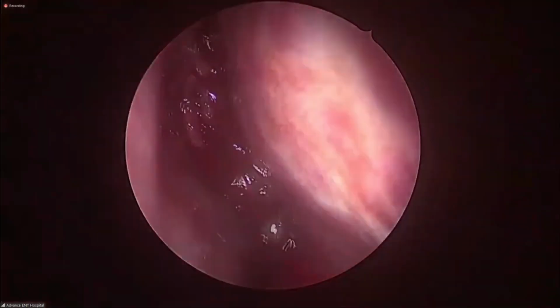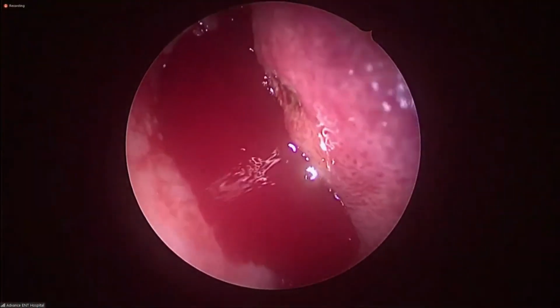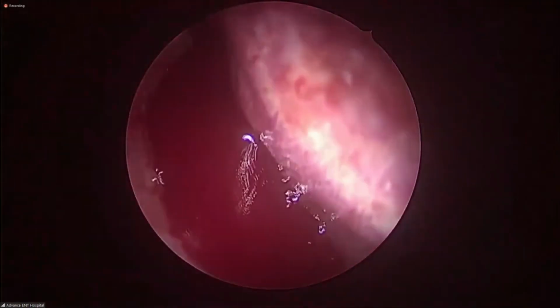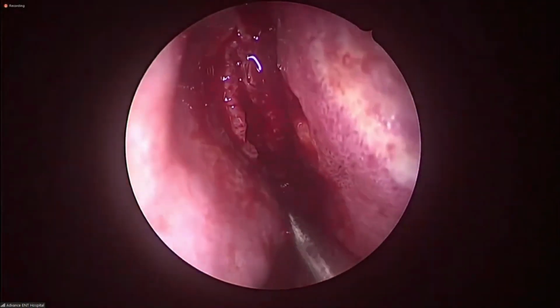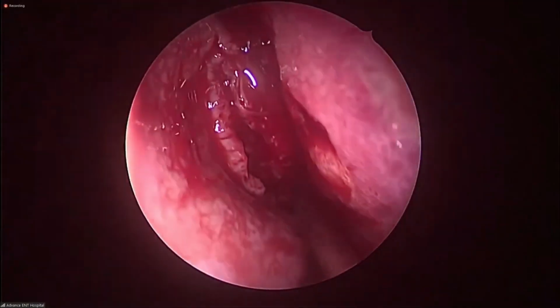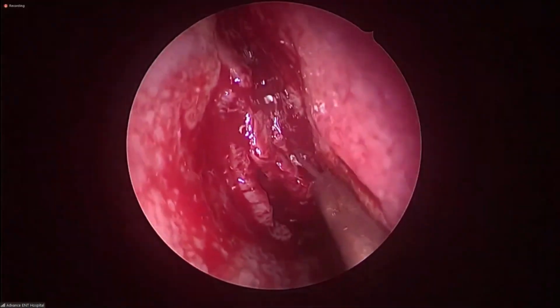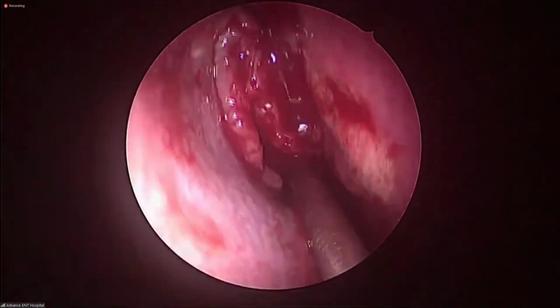Challenge persists with inflammation, difficult situation. There's no suction. Like that. See this? Yes, sir. Bleeding will be a problem in this case. No problem.